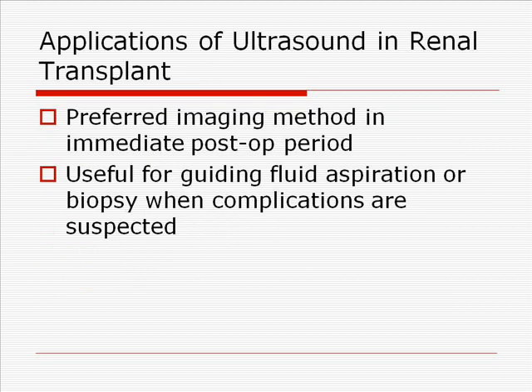Ultrasound is the imaging method of choice in the immediate postoperative period, and it's also used in the long-term follow-up of a renal allograft. It can also be used to guide diagnostic and therapeutic measures such as biopsy or fluid aspiration when there's a transplant complication.